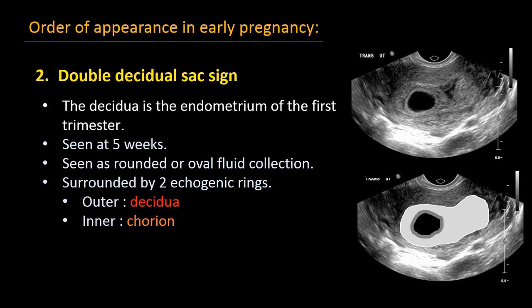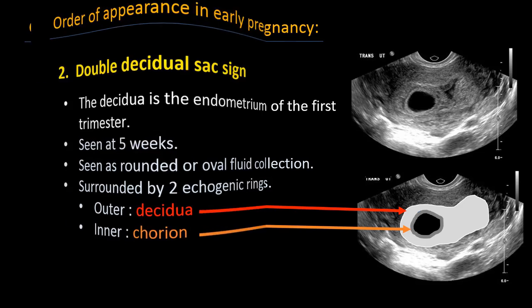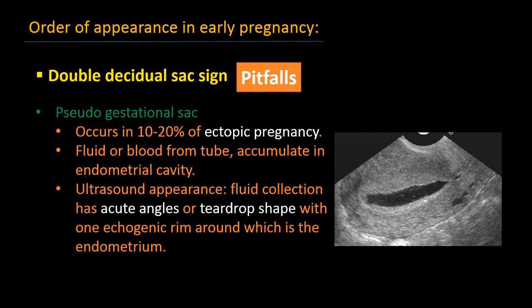As the gestational sac starts to grow, we get the double decidual sac sign. The decidua is the endometrium of the first trimester. Double decidual sac sign occurs at about 5 weeks. We have a rounded or oval fluid collection surrounded by an echogenic rim — this is called chorionic tissue — and another echogenic ring around it, which is the decidualized endometrium. The mimic of the double decidual sac sign is the pseudo-gestational sac, which is fluid collection within the endometrial cavity with one echogenic rim around it. When seen on one plane, it has acute angles, giving a teardrop appearance. This occurs in 10 to 20 percent of ectopic pregnancies and represents blood or bleeding from the tube that enters the endometrial cavity.